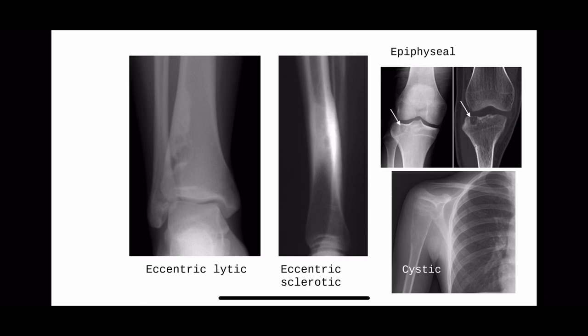This tumor is eccentric and lytic. The first words that should come to your mind are eccentric and lytic. It is more than 3 centimeters — it is not fibrous cortical defect, though you can use that term. This is fibrous cortical defect or non-ossifying fibroma. This one is eccentric and sclerotic — has to be osteoid osteoma. This one is epiphyseal, looks benign, cannot be GCT — chondroblastoma. This cystic lesion has a diameter no more than the native bone — looks like a simple bone cyst.